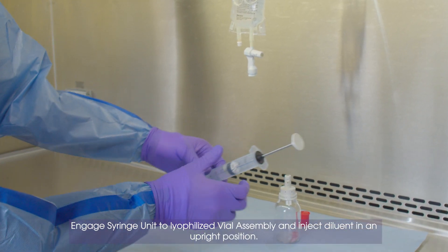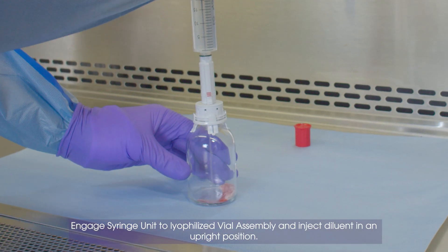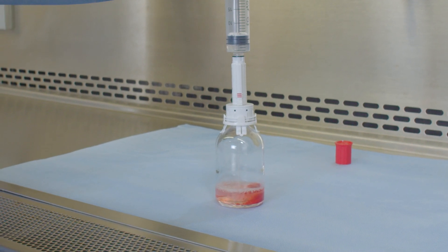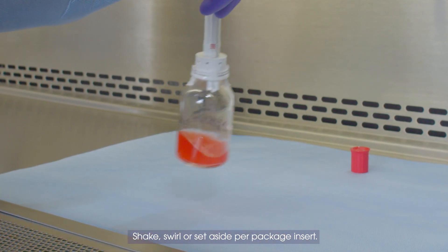Engage syringe unit to lyophilized vial assembly and inject diluent in an upright position. Shake, swirl, or set aside per package insert.